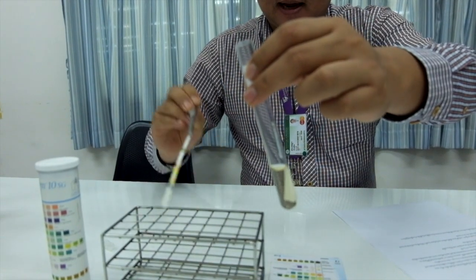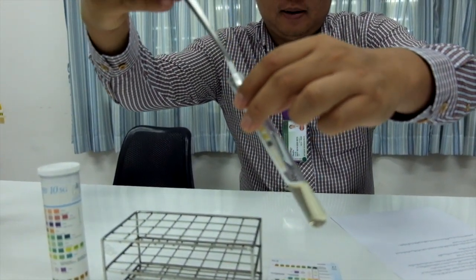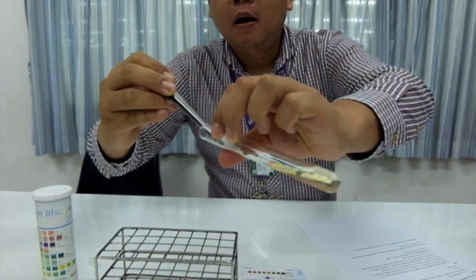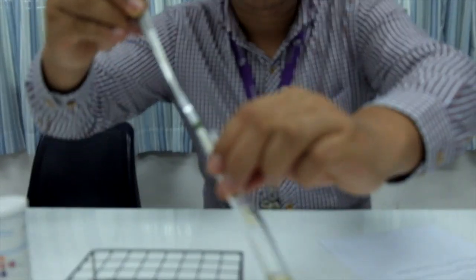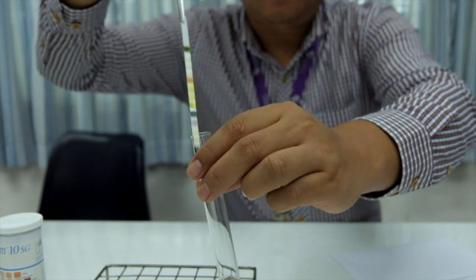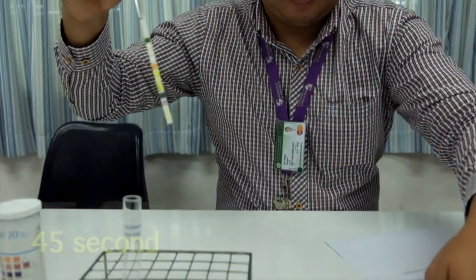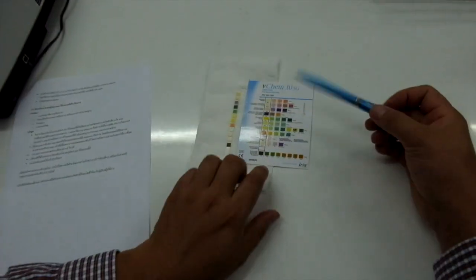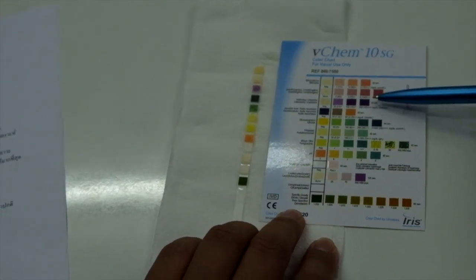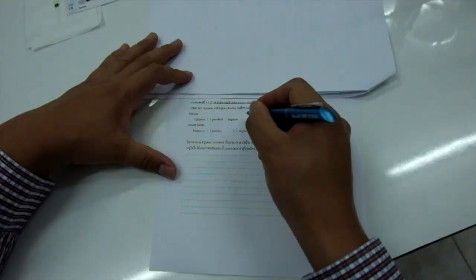Dip the strip into the unknown urine with the forceps. Try to tilt the tube to inundate all working area of the strip and try to gently remove excessive urine as much as you can. Place the strip on the tissue paper for 45 seconds, allowing the reaction to complete. Compare the results in glucose and ketone body area with the reference range. Interpret the results from the reference range and record it.